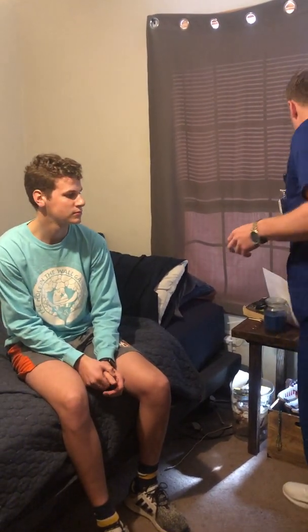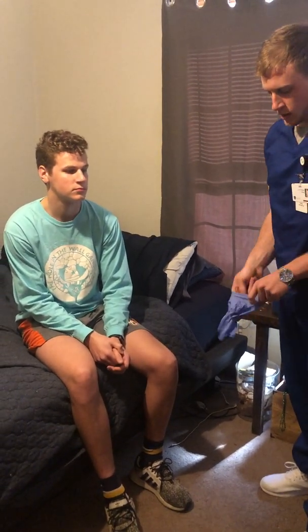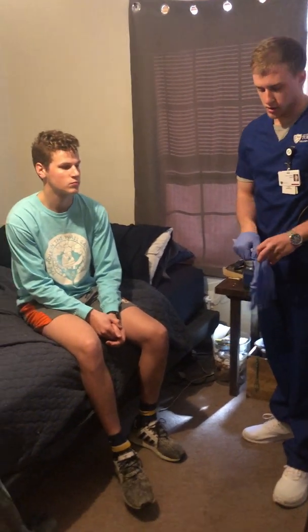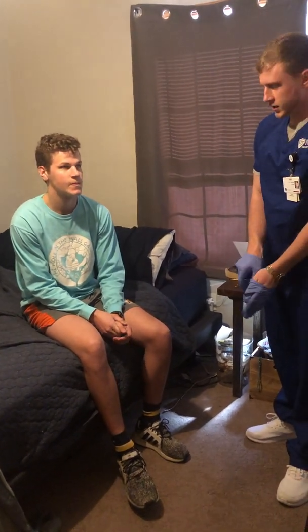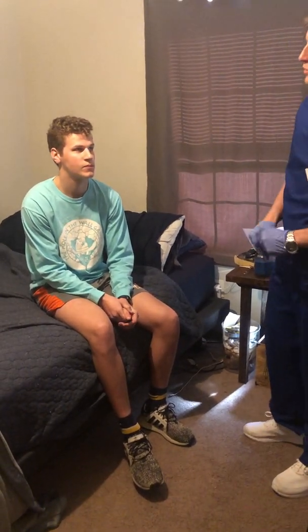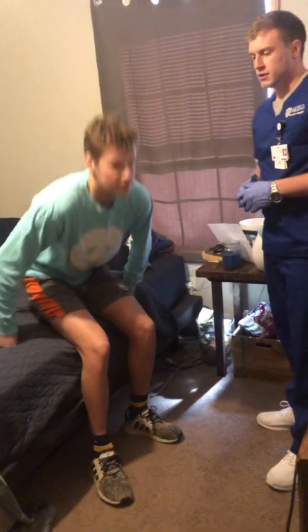So next thing I'm going to do is apply my gloves. I'm also going to provide privacy as needed for my patient. I'm also, as I do this, going to ask my patient 2 pertinent medical questions that have to do with the exam we're doing today. So, do you have any history of a heart murmur? No. And do you have any history of heart attacks? No. Alright, perfect. So the first thing I'm going to do is have you stand up and please remove your shirt because we're going to take your heart sounds.